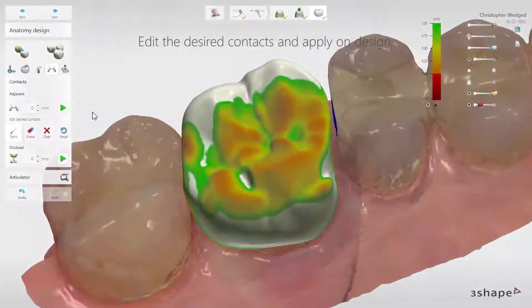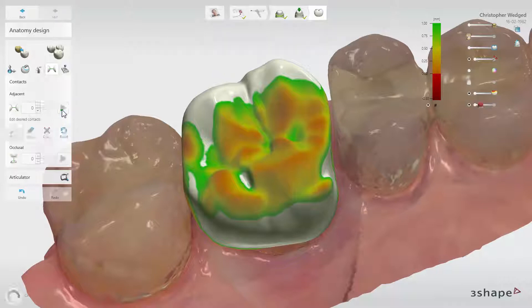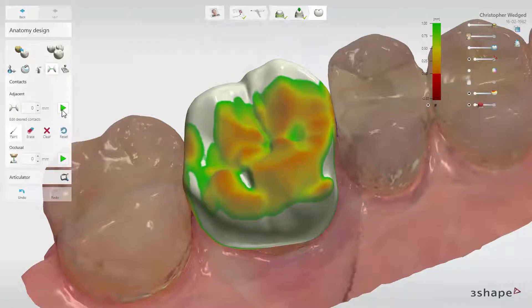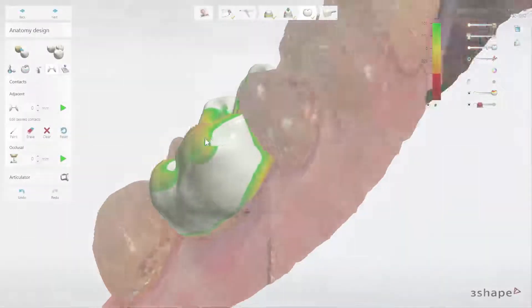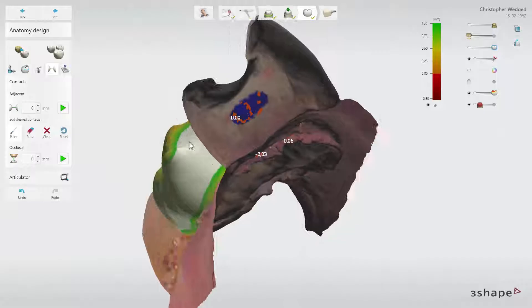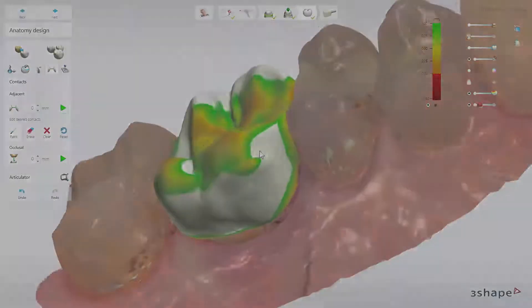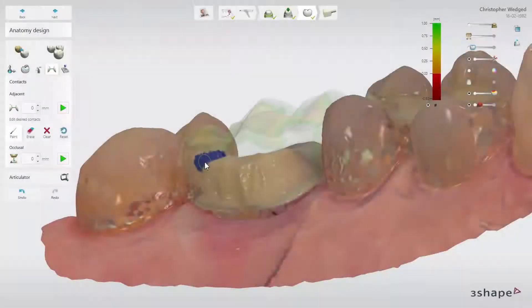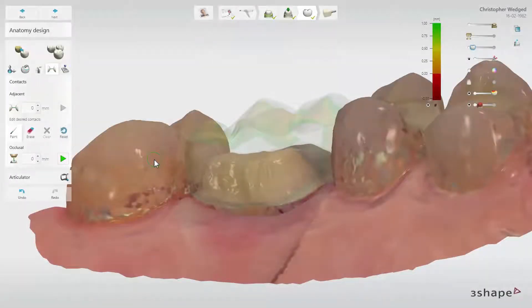Note that the Adjacent Contact tool will increase the size of the tooth to create desired contact points if needed. To remove the contact area, use the Clear button. To restore the initial contact points, click the Restore button.